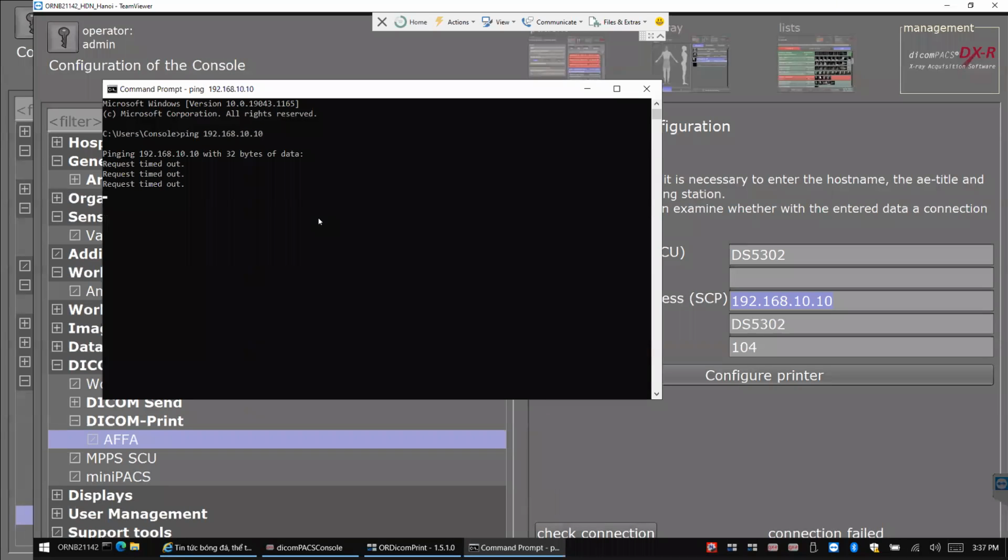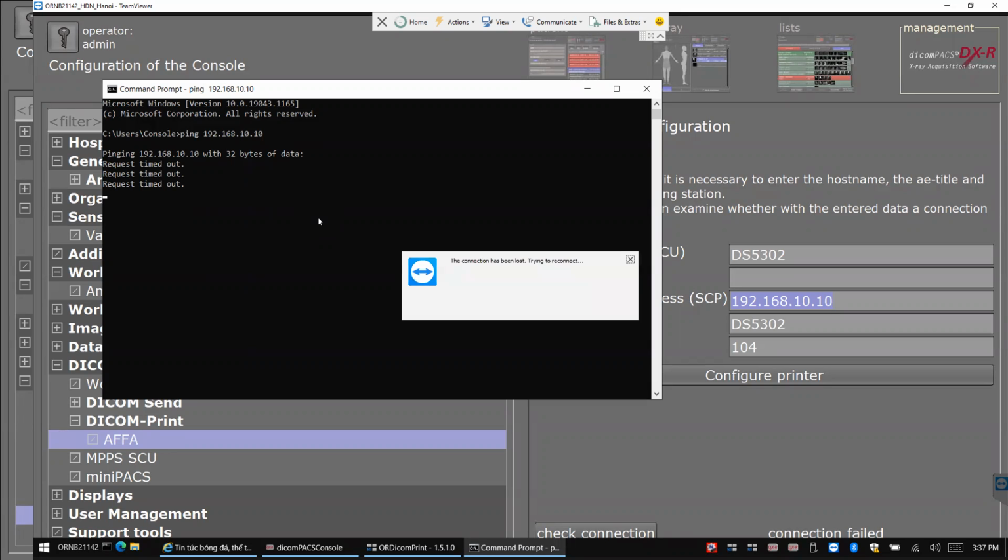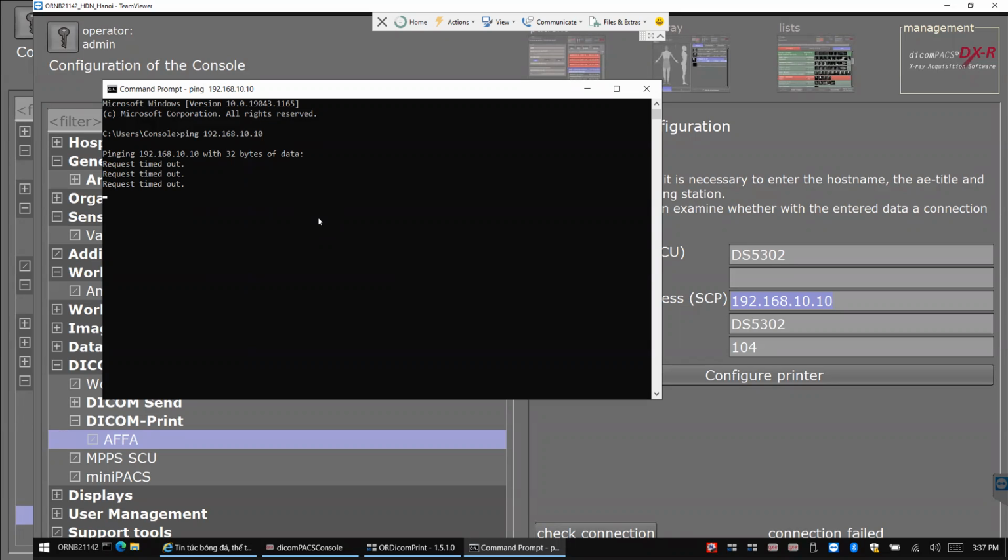But we have a question relating to last week's case. The installation was successful and we printed the study. But the laptop informed us that the print was successful, but in reality it is not.